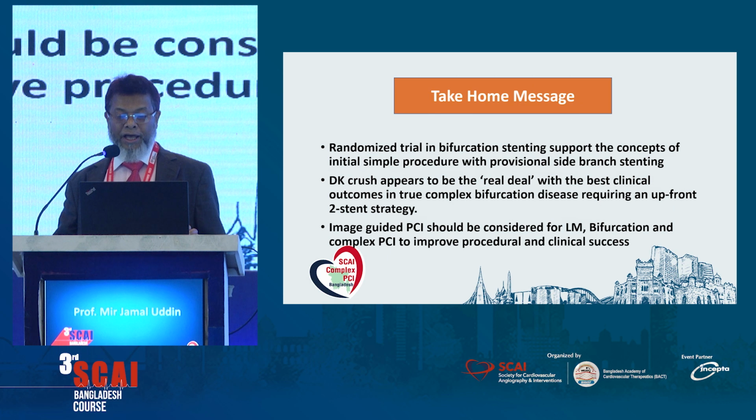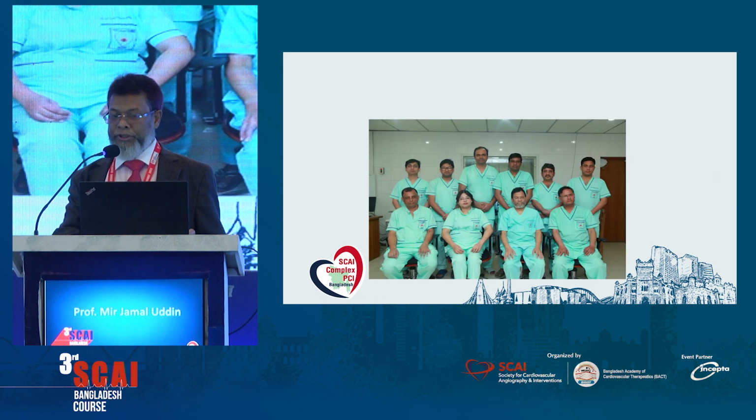DK crush appears to be the real deal with the best clinical outcomes in true complex bifurcation disease requiring an upfront two-stent strategy, and image-guided PCI should be considered for left main, bifurcation, and complex PCI to improve procedural and clinical outcomes. Thank you. Thank you all.